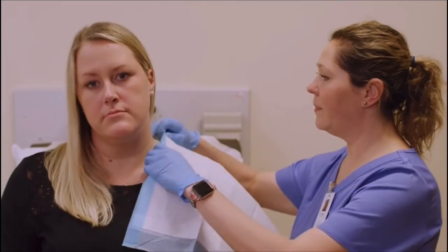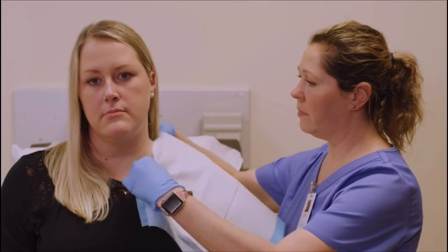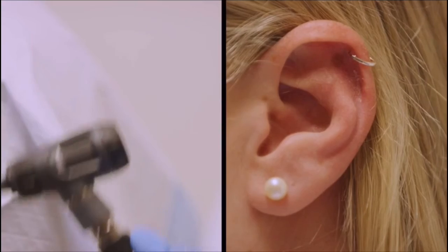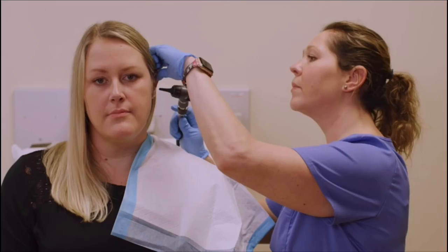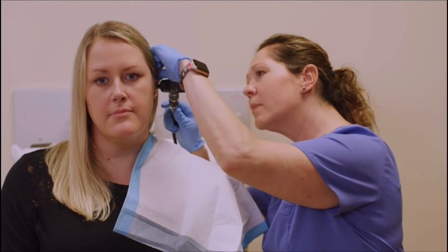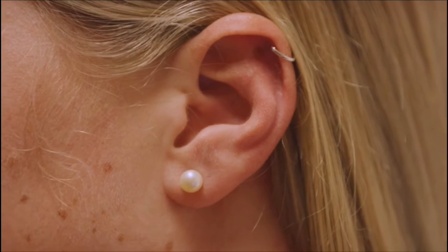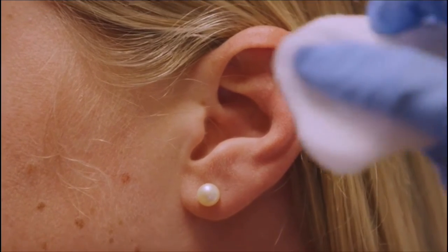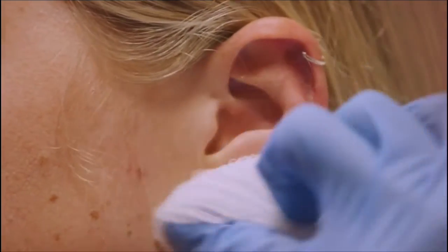Place a waterproof drape over the patient's shoulder on the side that you'll irrigate. If your facility policy allows, use an otoscope and pull the pinna of the patient's ear up and back, gently inserting the speculum. Pay attention to any obstructions or blockages from foreign bodies or cerumen. Spray enough irrigation solution onto a gauze pad to moisten it, then cleanse the patient's outer ear.